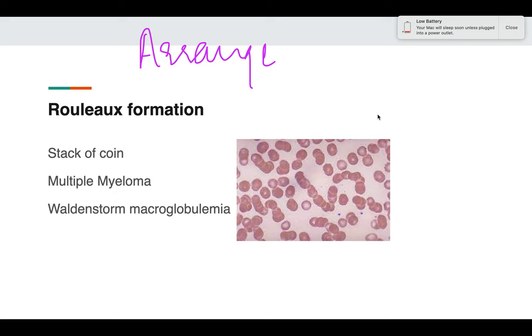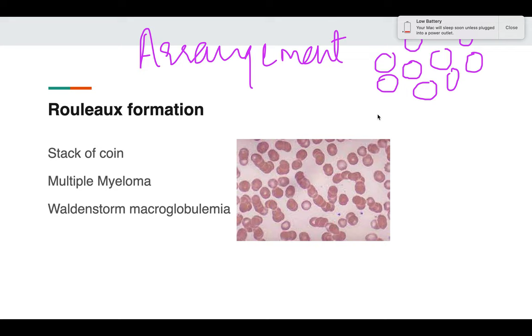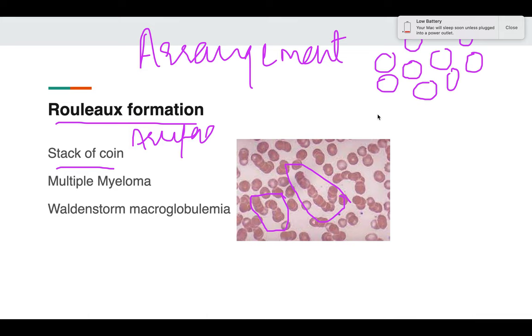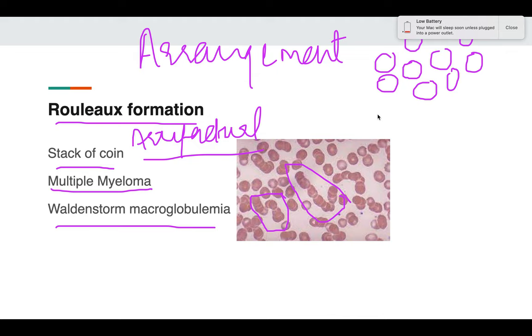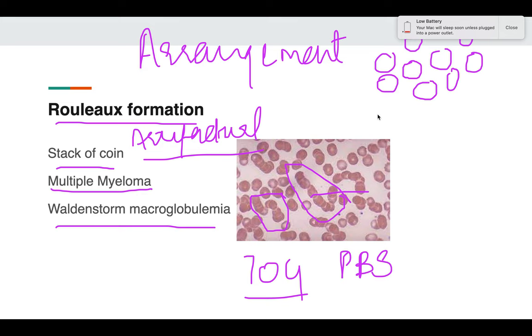Regarding red cell arrangement: normally RBCs just touch each other. In rouleaux formation, the RBCs appear as a stack of coins. This can be artifactual, but if artifactual causes are ruled out, it is very importantly seen in plasma cell dyscrasias such as multiple myeloma and Waldenström's macroglobulinemia. If an older male presents with a PBS showing rouleaux formation, multiple myeloma should be ruled out.